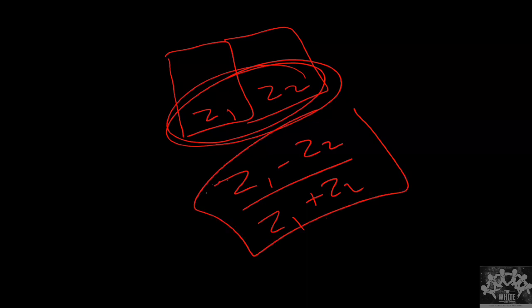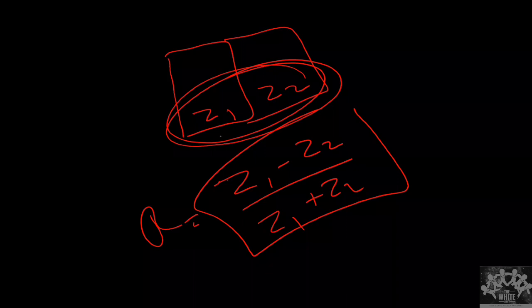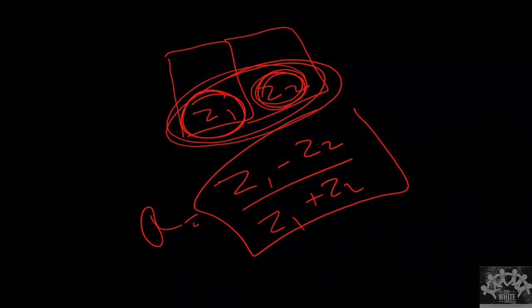You don't have to remember the formula, but you need to know that the resistance offered by any tissue is called impedance. The difference in the tissue tells how much sound is getting reflected back. The difference in the resistance offered gives us how much sound is reflected back, or the difference in the impedance, where Z1 and Z2 are nothing but impedance, or the resistance offered by the tissue.